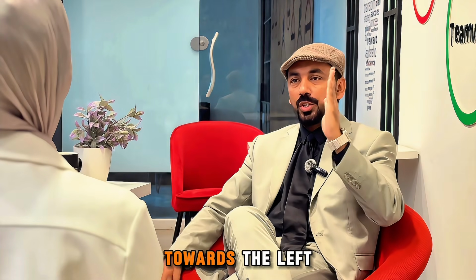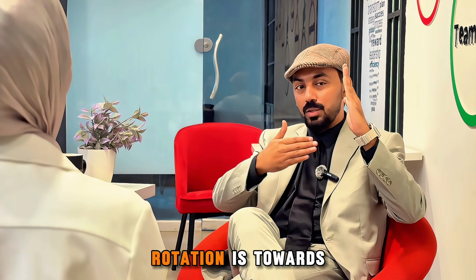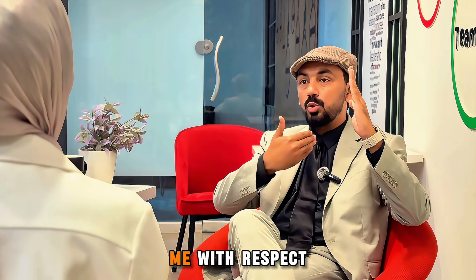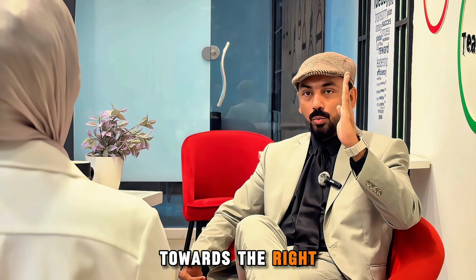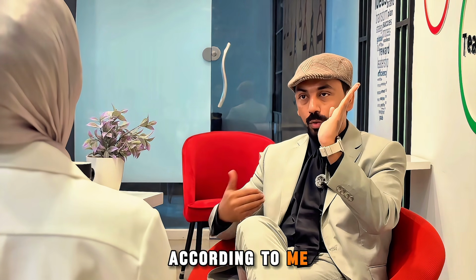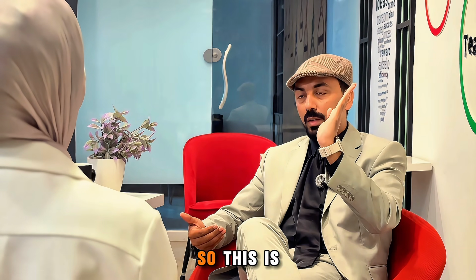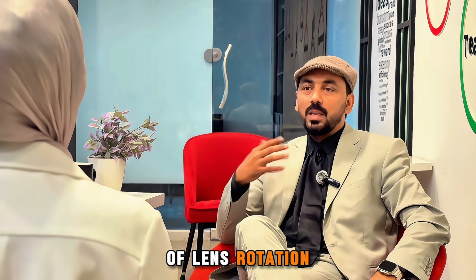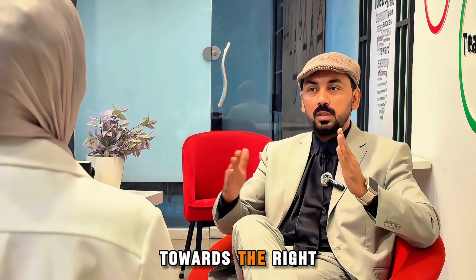So if the lens rotation is towards the left side by 1 clock hour, we will add 30 degrees, right? We will add 30 degrees because the lens rotation is towards the left side with respect to me, the practitioner. And if the lens rotation is 1 clock hour towards the right side, according to me, the practitioner, we will subtract 30 degrees, right? So this is the whole concept of lens rotation and how many degrees of axis we have to add or subtract, whether the rotation is towards the left side or towards the right side.